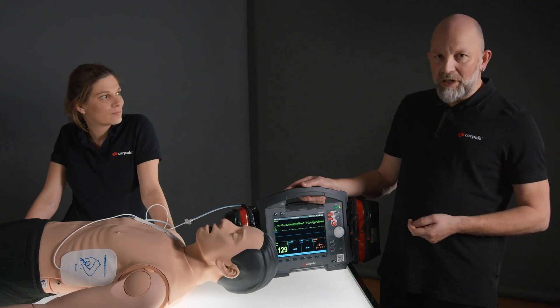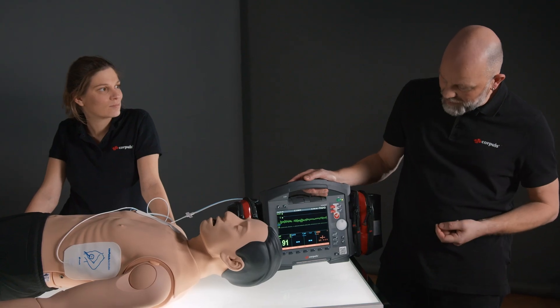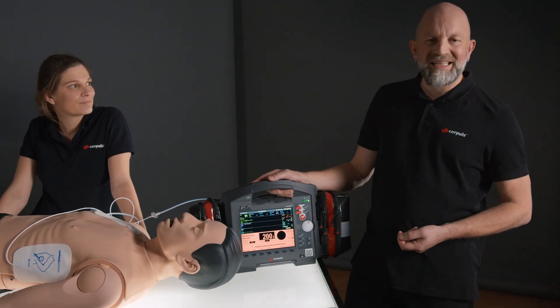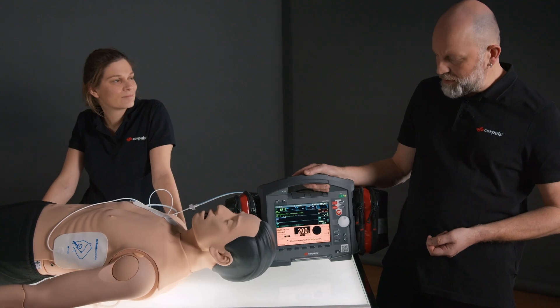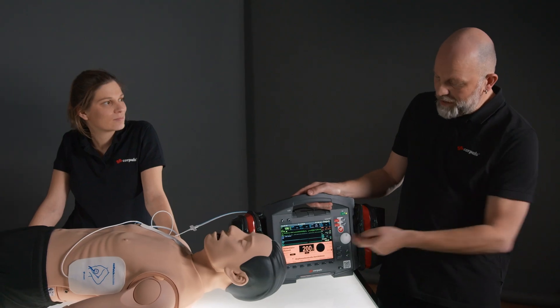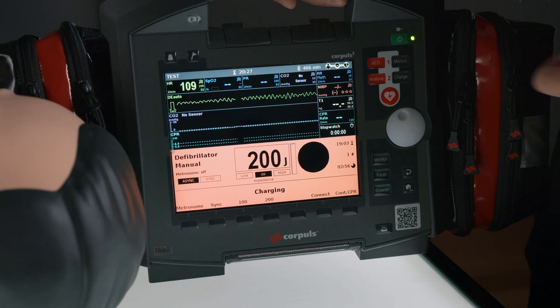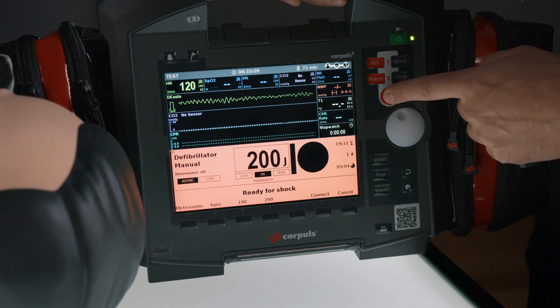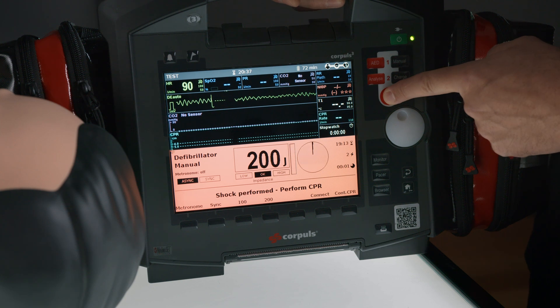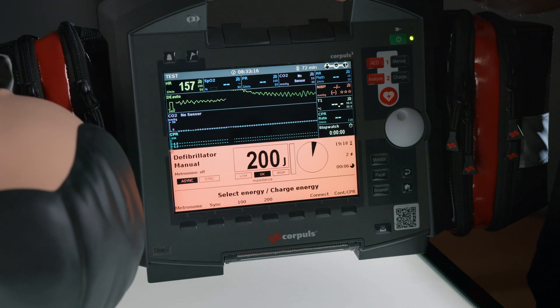To begin manual defibrillation we first need to select the manual key. We will be prompted to perform a rhythm analysis. In this case, we decide that we want to defibrillate with 200 joules without synchronization. We load the preset energy, press and hold the shock key to apply the energy, then afterward we continue CPR.